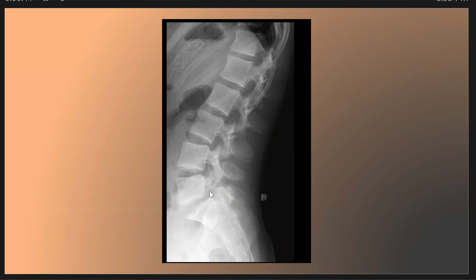We see here pars interarticularis defect bilaterally, as we see here at the L5 level, and we also see a spondylolysis.